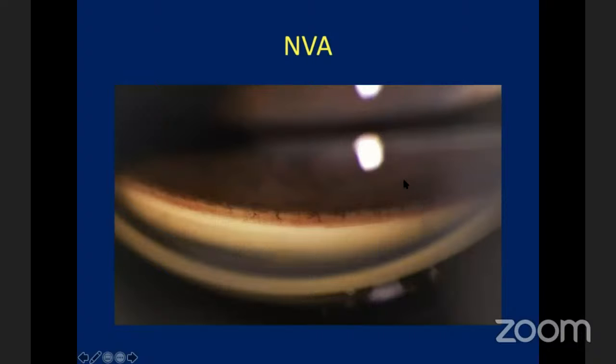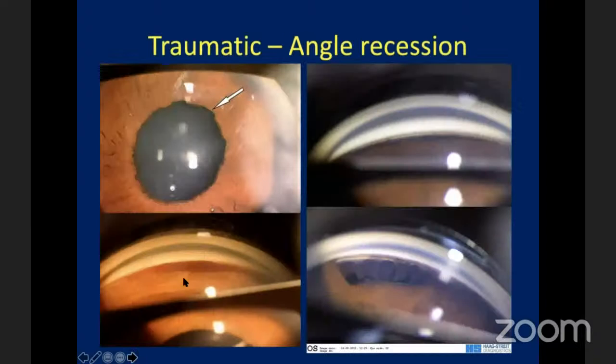This is a patient of central retinal vein occlusion, and you can see the new vessels. These are diffuse, irregular, arborizing vessels crossing the scleral spur. So that is a pathological neovascularization of the anterior chamber angle. Very important thing to do undilated gonioscopy in diabetic patients and vascular occlusions. To identify this patient requires immediate pan-retinal photocoagulation.